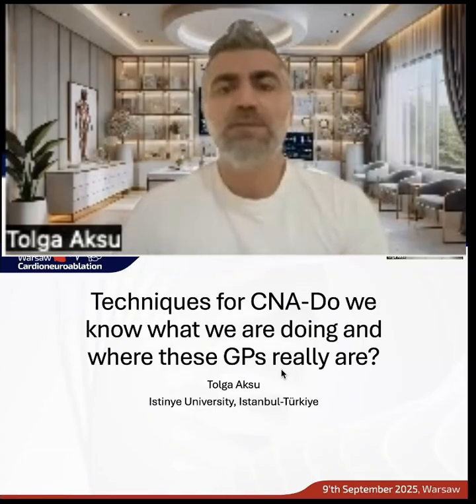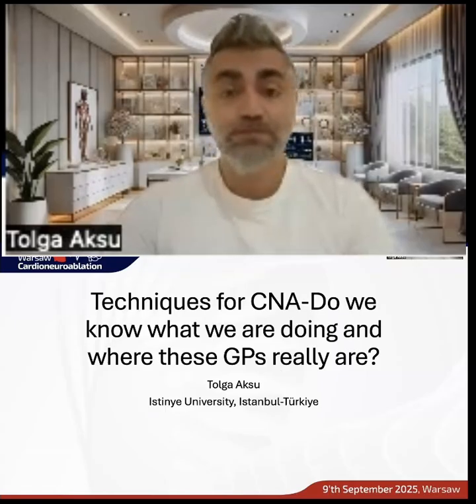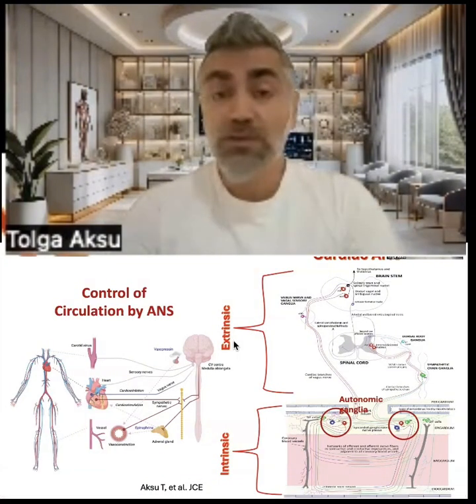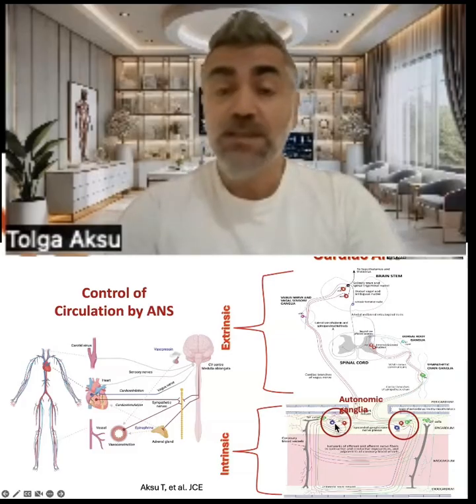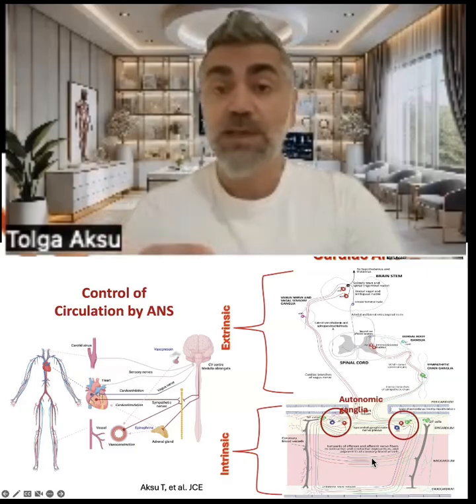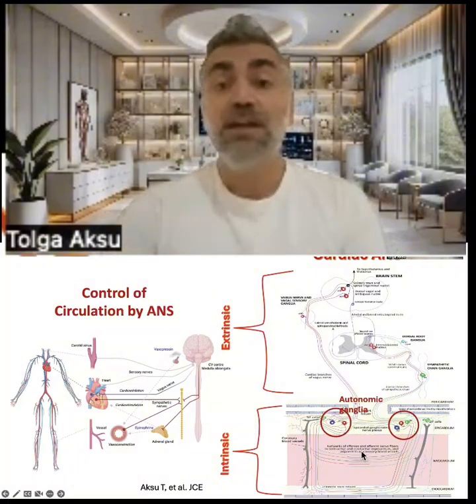Today, I will try to briefly discuss GP mapping methods and GP ablation methods. As you know, we can divide the cardiac autonomic nervous system into extrinsic and intrinsic parts. In the intrinsic part, there are autonomic ganglia in the epicardial area which contain neural bodies of the parasympathetic and even sympathetic system. But there are also postganglionic neuronal fibers from these autonomic ganglia to the sinoatrial node and AV conduction system, and these postganglionic fibers usually travel at the myocardial and even endocardial level.